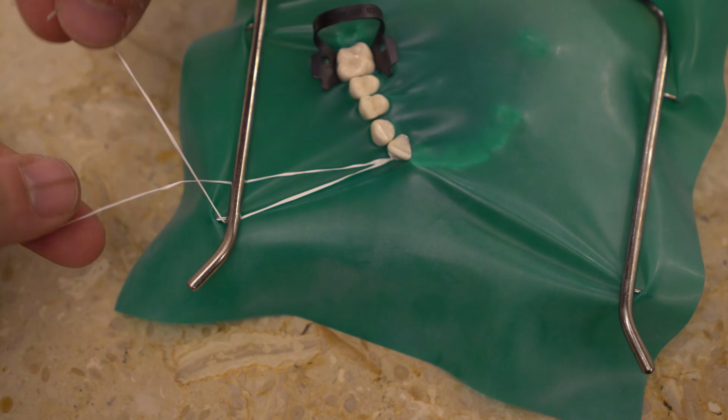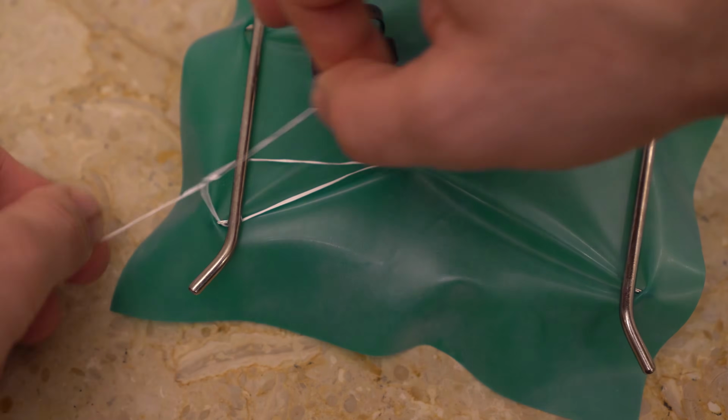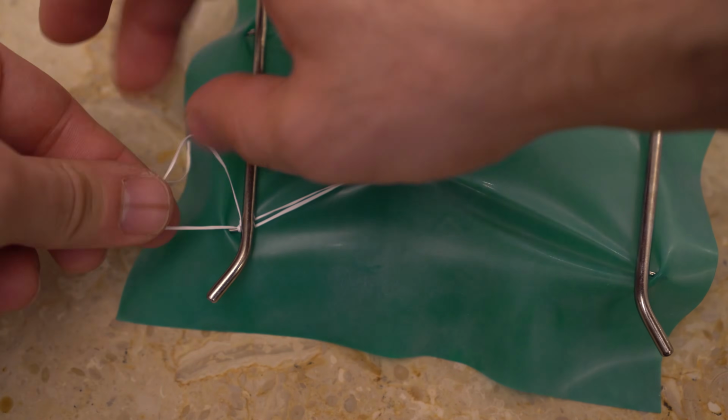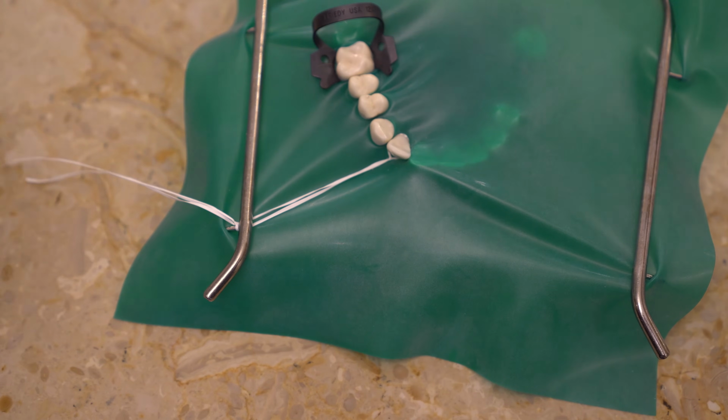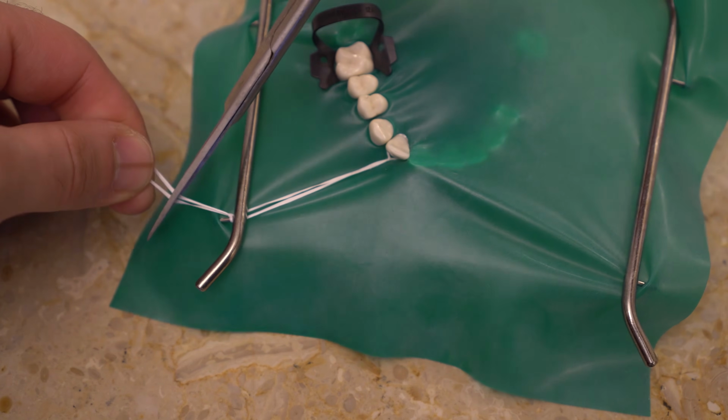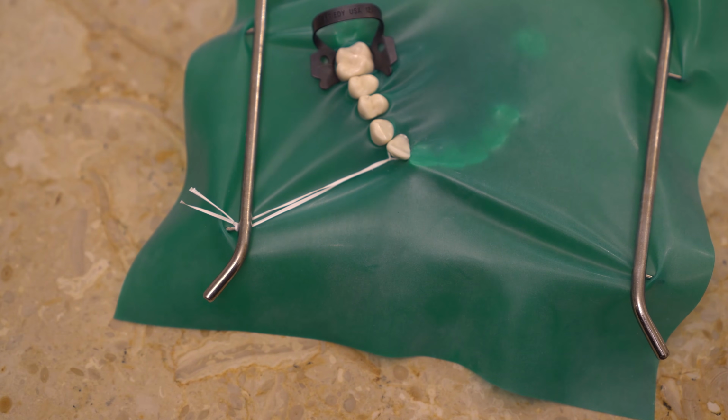This way, the excess floss stays out of the way and it stays nice and taut. And this way, it pushes the lips out of the way slightly as well, which makes it easier for you to do your anterior work. For the upper left side, tie it to the left side of the frame, and for the right side, tie it to the right side of the frame. This may take a few extra minutes, but it makes your work a lot easier.